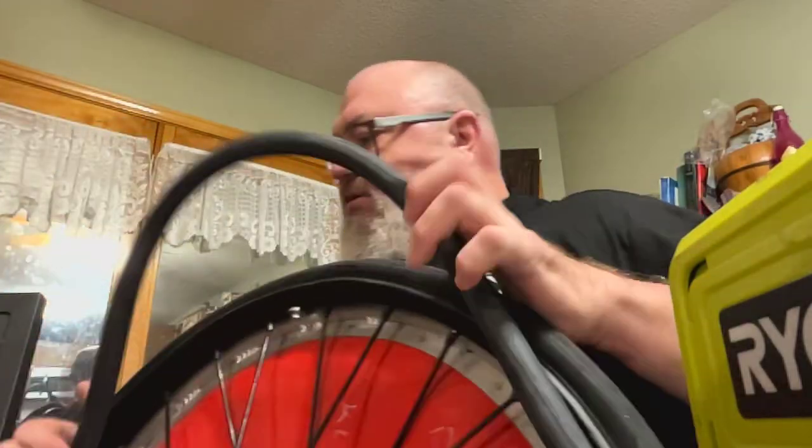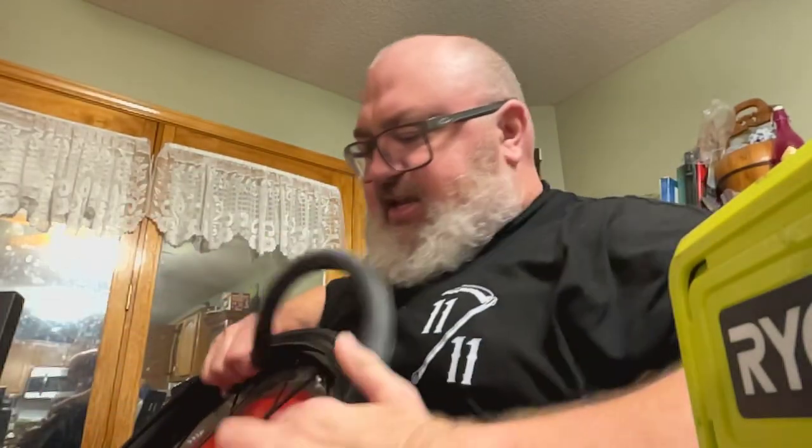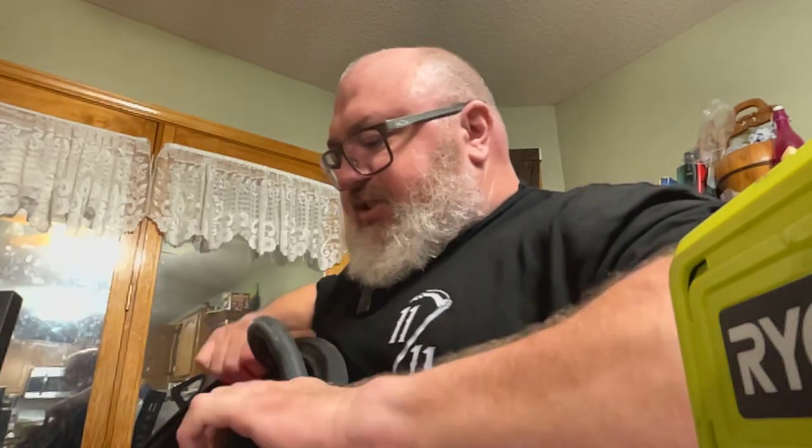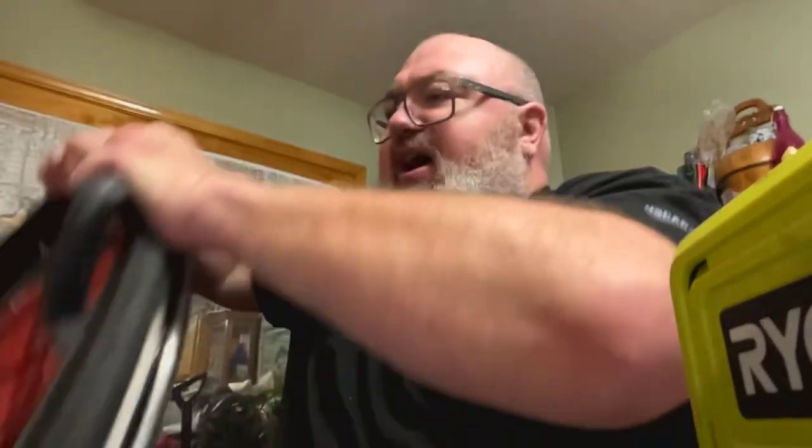So what I'm trying to do is just push that tube into the tire where it's kind of seated into the tire. And then you kind of roll it around, find that magical groove. Might need to let a little bit of pressure out, but it will work for what we're doing. This is a 26-inch tire. 25s, you can use 26, you can use 25s. 25 tires are typically a little easier to load in. Actually, it says 25. So, I don't know.